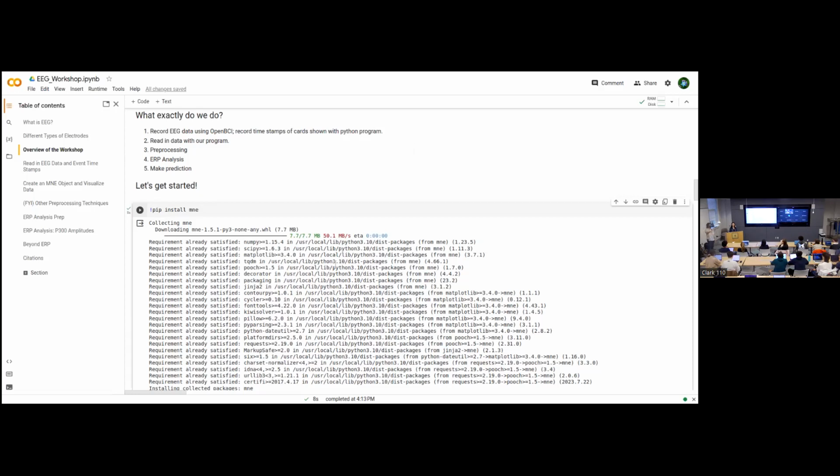Just as a side note, we're passing around one of the spikes. They don't have a specific name, it's just the way they look, pretty spiky. That's why we say it is a particularly uncomfortable piece of headset, because it's just an array of these electrodes sitting on top of the head. We have to screw them in so that it's tight, so it's pretty uncomfortable.